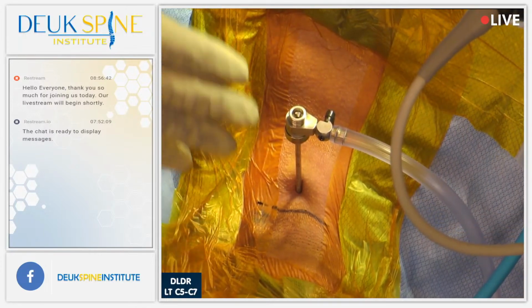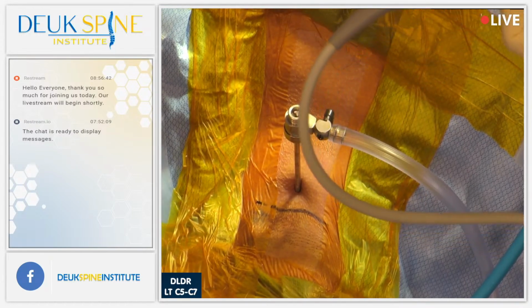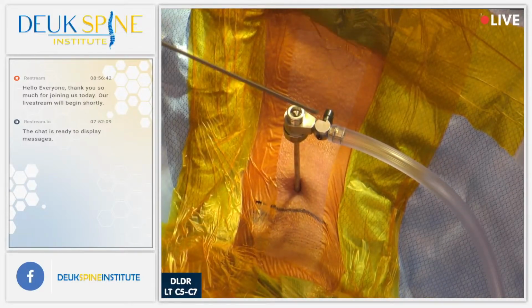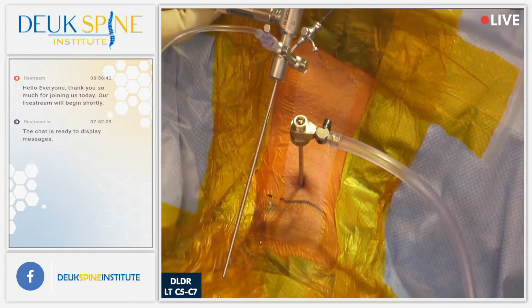The entire spine world will eventually go to endoscopic. Unfortunately, it's been corrupted by greed and ignorance. And so until that gets fixed, people are going to still get fusions and artificial discs, which they shouldn't be getting. All right, so this is the endoscope, for those of you wondering.